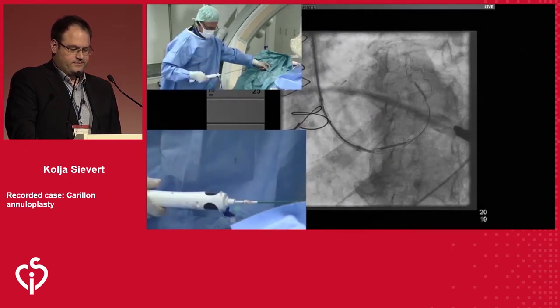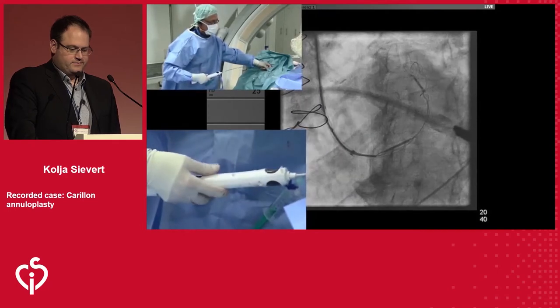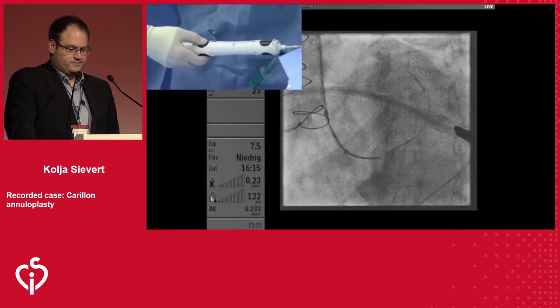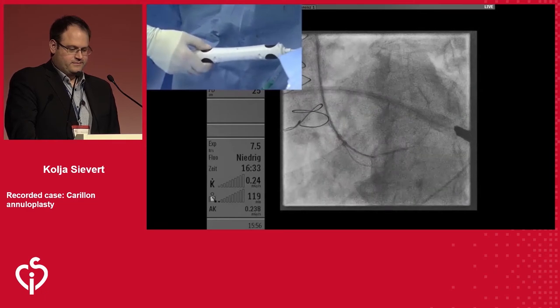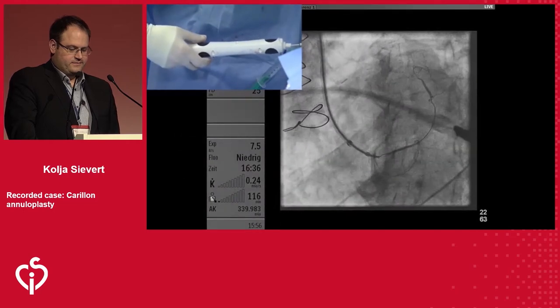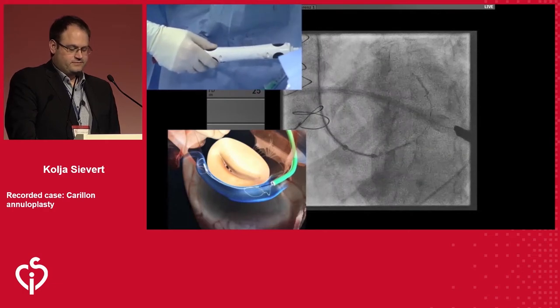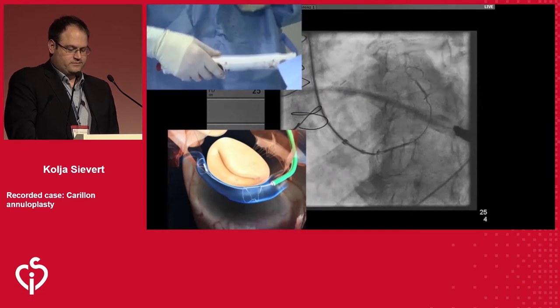Mm-hmm. So can you look at his hands here? So now he's moving to the second knob. And now he's got a control knob which is going to push out the proximal anchor. So you're starting to see the proximal anchor coming out. Now you can rotate back so that we can see the lock. So we're going to get that pusher catheter just out of the way, but you're basically done with a case. Okay, so what do you think?